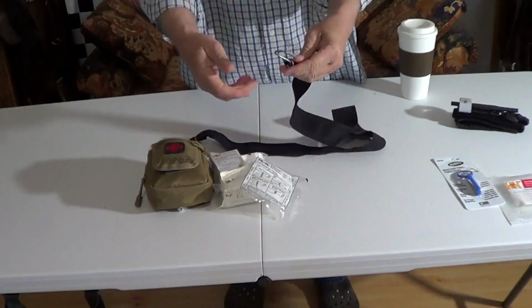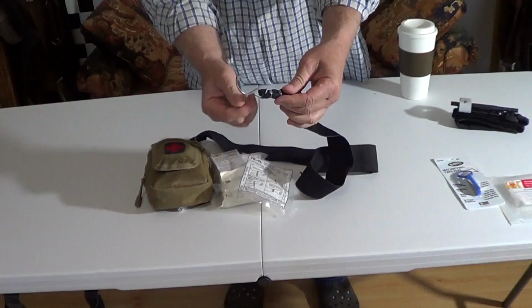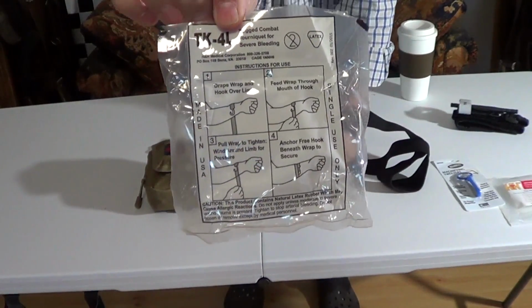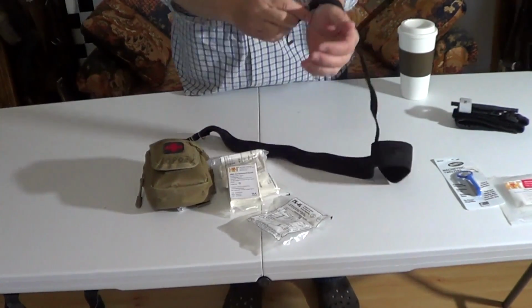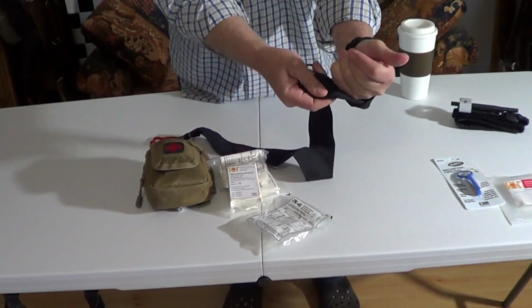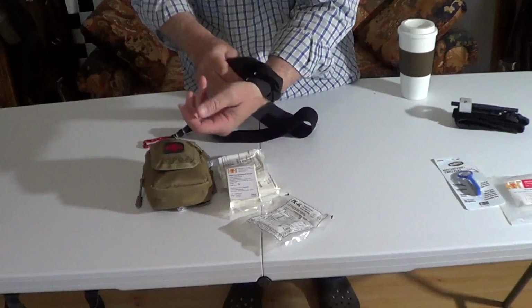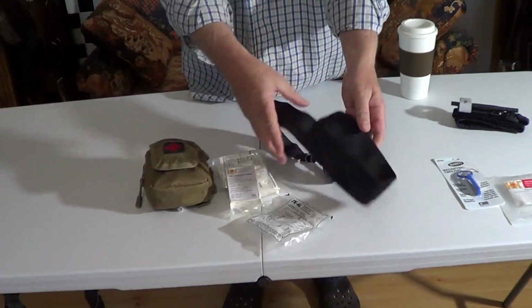It's got a rusty hook. It's got wire in here. It says when you put it on, you lay the hook here. If somebody wants to pause it and read the directions on what a crappy tourniquet this is, it says you hang this here, and then you put this through the hook, and then you pull this back, and the hook kind of comes undone. I mean, good grief, if I had a tourniquet myself with this, I'd be screwed. Now, if I didn't have anything else, then I guess this would be okay.